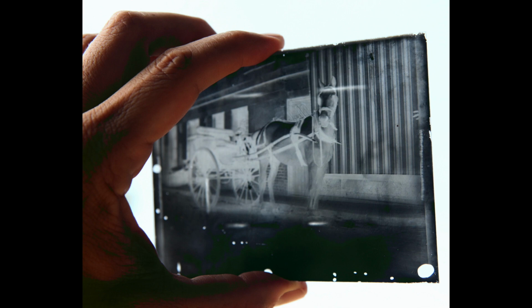So anyways, Röntgen happened to have these glass plates lying around, and 6 weeks after he discovered X-rays, Röntgen made an X-ray image of his wife's hand. And here it is. So much like today, the X-rays were directed towards his wife's hand, while an imaging material, in this case the glass photography plate I showed you, was behind her hand.